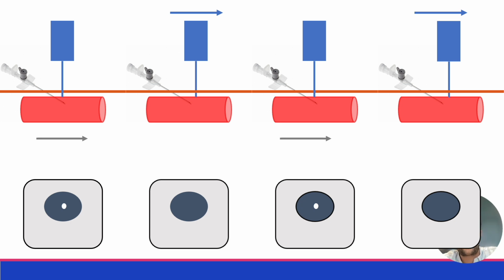Okay, a number of reasons for this. If you just get flashback, the plastic tip of the cannula might not be in the vein, it won't advance properly. Additionally, if you've put too much pressure onto the vein, and then when you lift the ultrasound probe off, the anatomy might spring up and the vein might go out the back of it. Whereas if we do this, it will force us to flatten out our angle and make sure more of the cannula is in the vein and make those less likely. Obviously there will be a happy medium, as the further you go in, the more likely you are to go through the back.